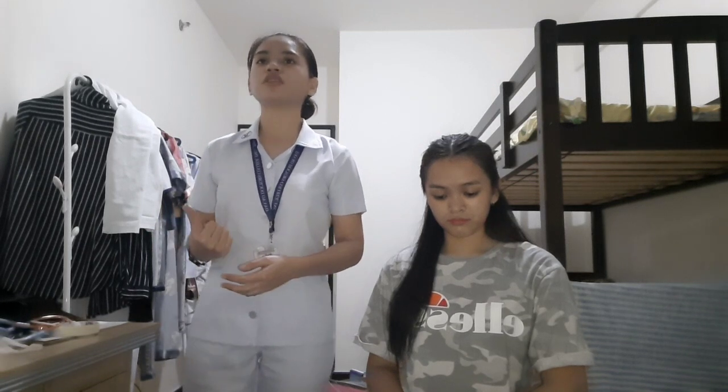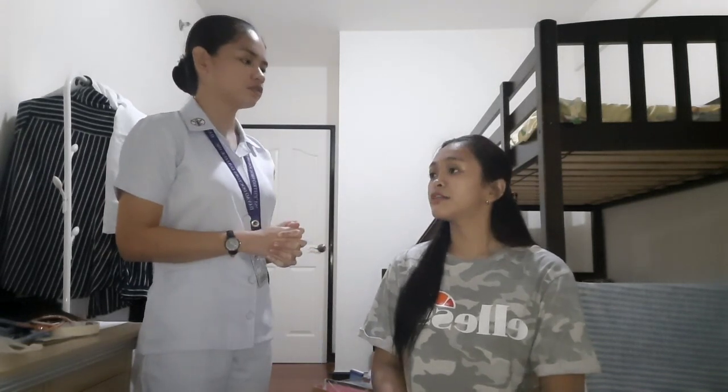Then I will determine the best arm to use. It's best to take the blood pressure in the non-dominant arm, which is the left if the patient is right-handed. Ma'am, are you left or right-handed? Right-handed. Okay, thank you.